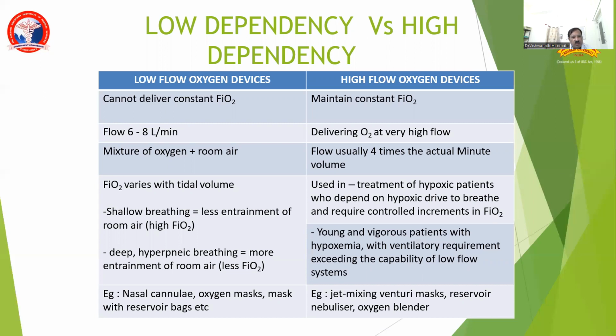In case of a low flow device, FiO2 varies with the tidal volume. Shallow breathing results in less entrainment of room air, resulting in high FiO2. Deep and hyperapneic breathing results in more entrainment of room air, resulting in less FiO2.